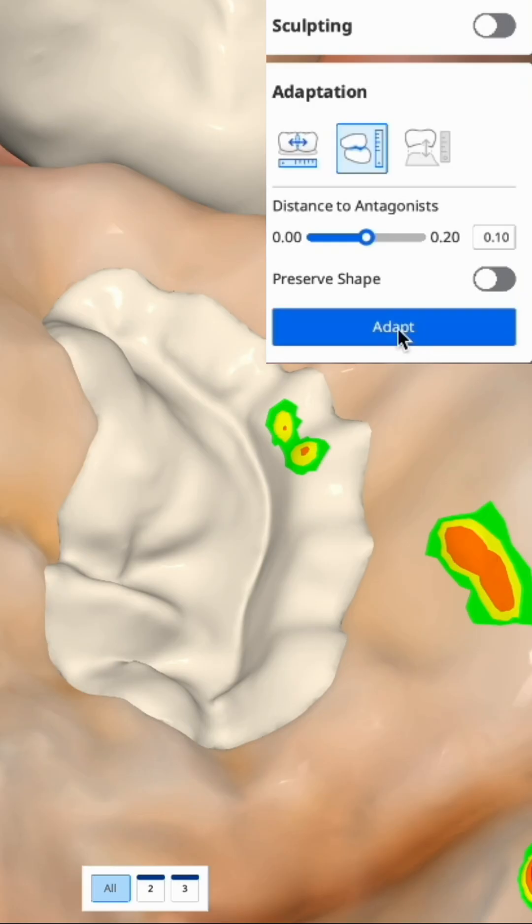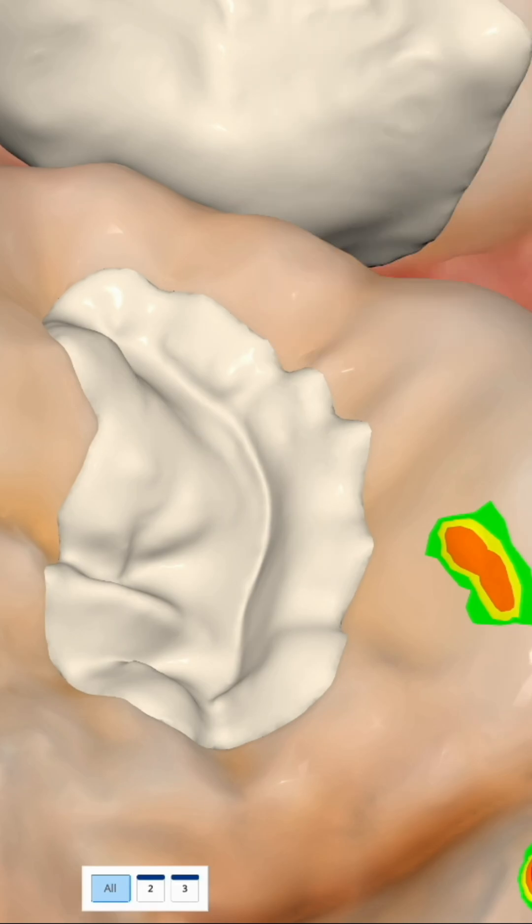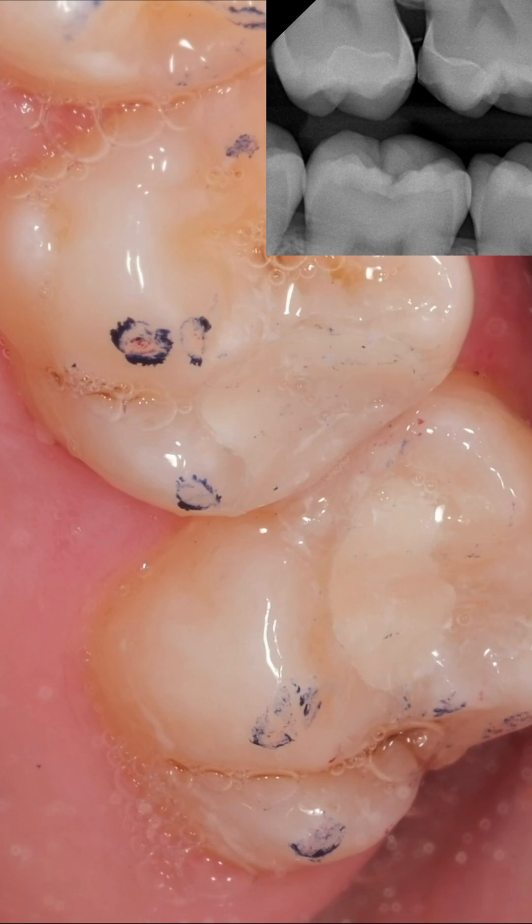We also want to do our adaptations as well, making sure that we are enforcing our minimum distance between the antagonist and our contact. Here's an image of the inlay cemented prior to polish — super impressed.